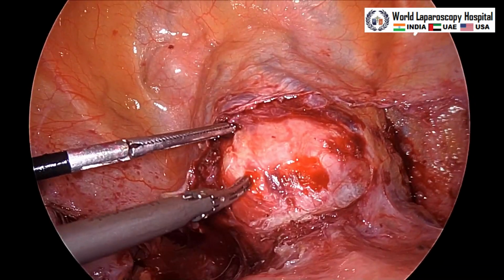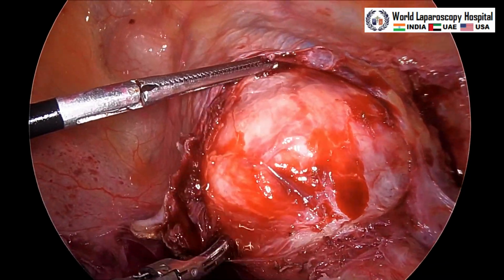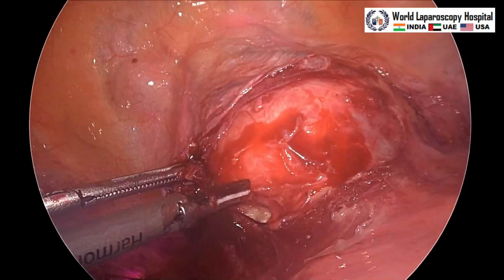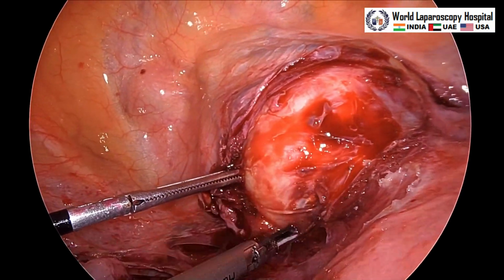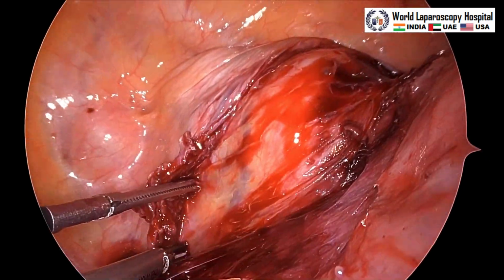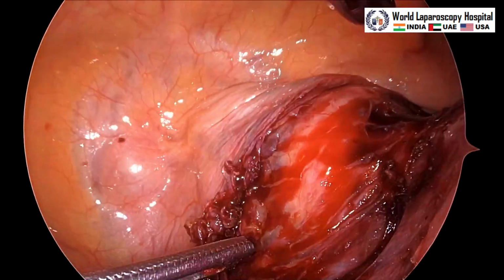you have to do lateralization of the bladder pillar, so that when you take the uterine you will have proper hemostasis. The bladder should be separated at least 3 cm. Sometimes if your bladder pillar is thick, you may use the harmonic to cut it and then lateralize. This portion of the lateralization is very important to prevent injury of the ureter. So this is an important step, and this way you can push the ureter further lateral. We can see the ureter is going further below. You can see the light of the ureter.